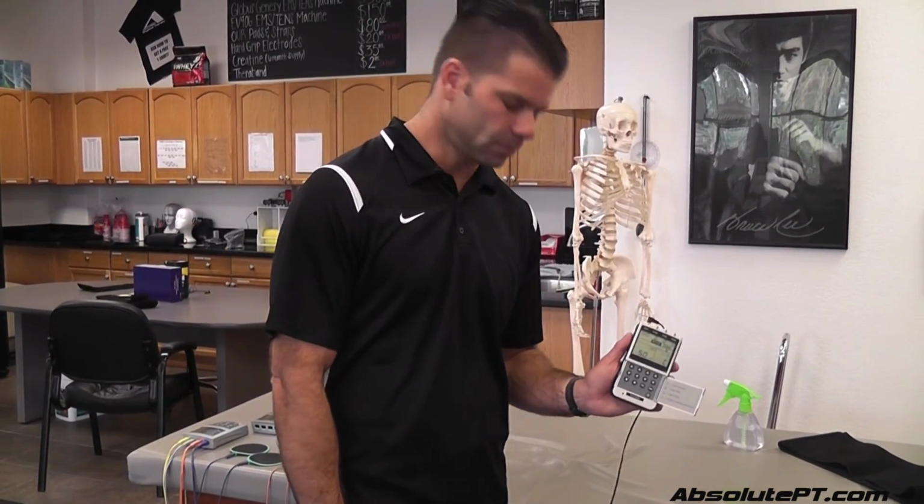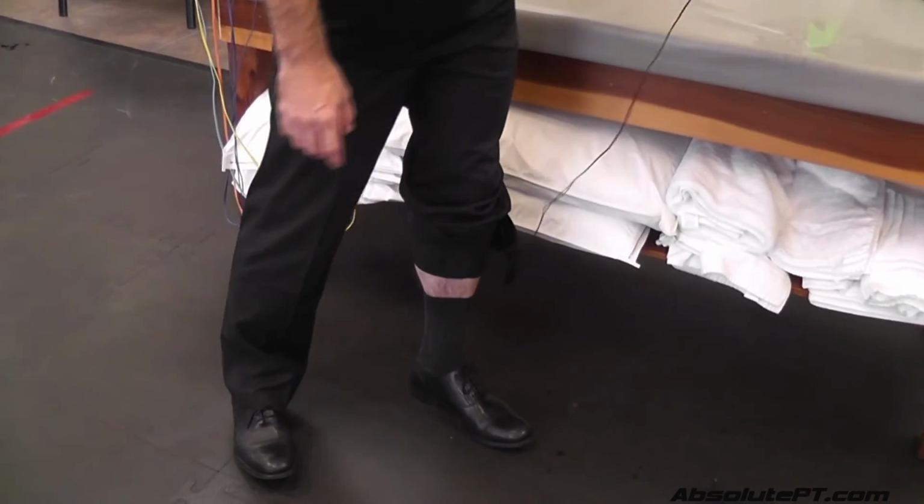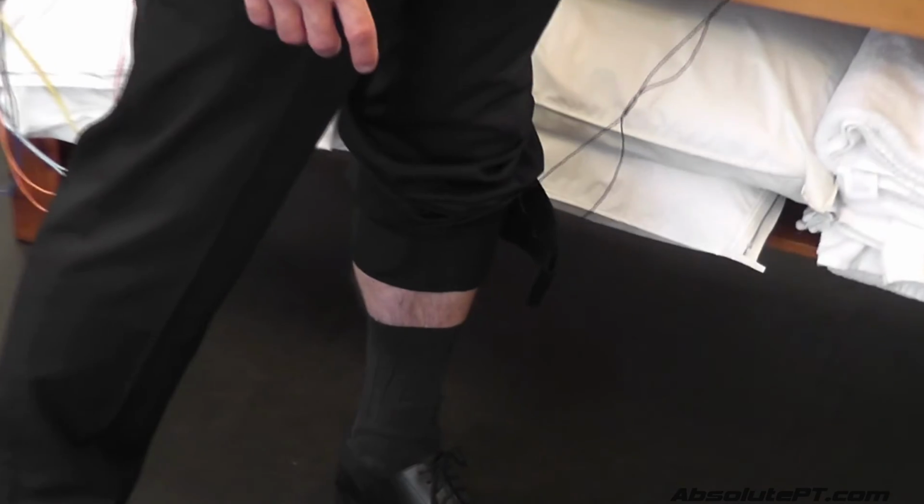And for this video, we'll let it go through. Oh, and there we go. So my muscle's contracting, it's pushing me around. That's how I program an EV906.